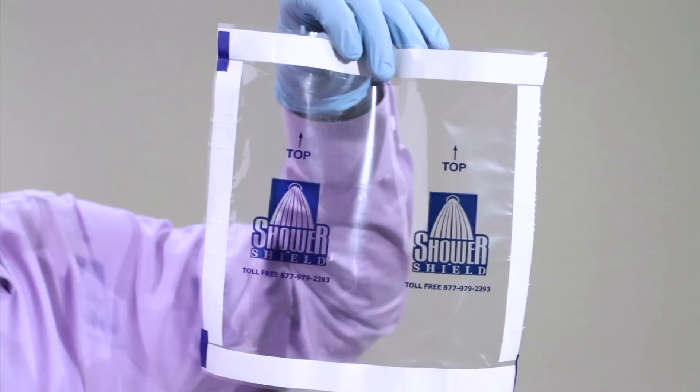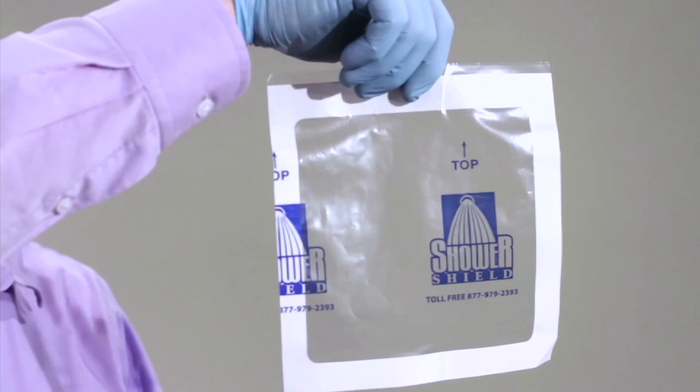As you can see, Shower Shield is a large dressing and it comes in a variety of sizes, with 7 inch by 7 inch and 9 inch by 9 inch being the most popular.